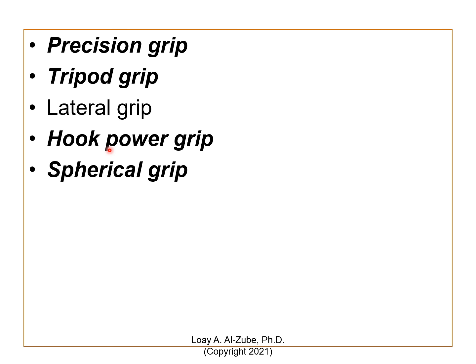I have a couple of grips here, but they are just the alligator grip, which just closes on itself, two pieces. Spherical grip is for holding spherical objects, because holding a ball is different from holding, let's say, a cup. The hand is really a complex structure to allow us to do all these movements. You can select one of these, but the best is to design something that can do all of those for one subject.